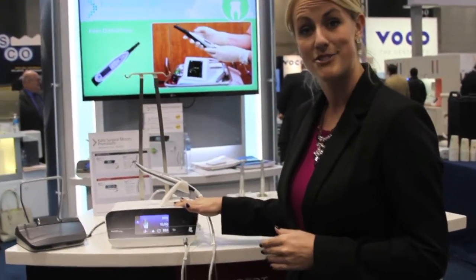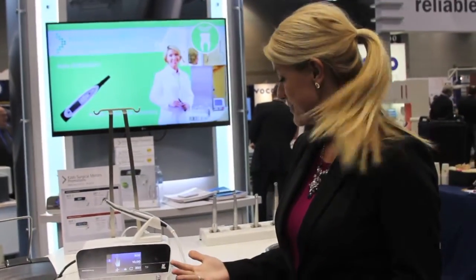More features on the Master Surge: it has a one-touch calibration system. It's super easy to make sure that no matter what attachment you have on, the motor is going to give you the power and the torque, especially what you need for the implant system.